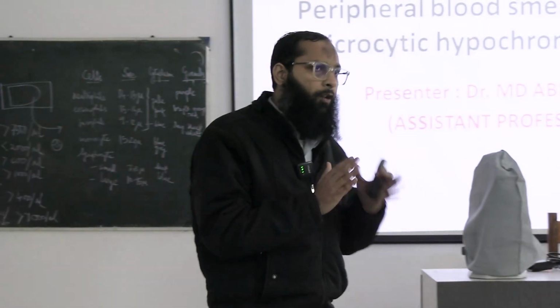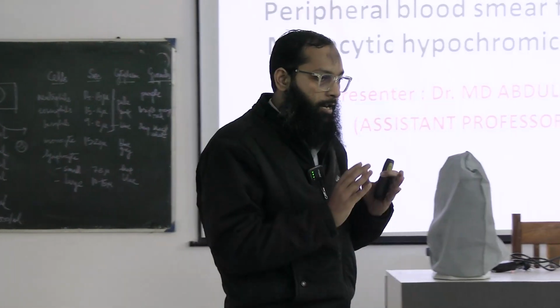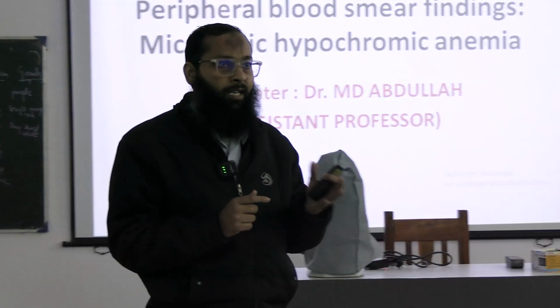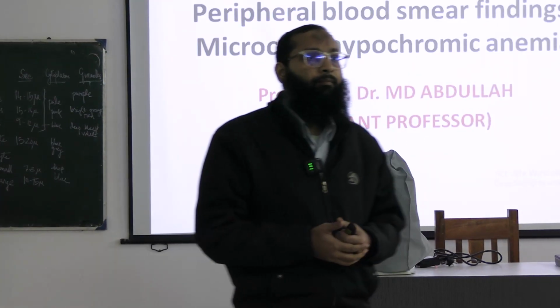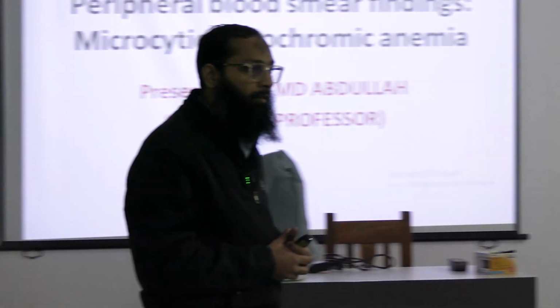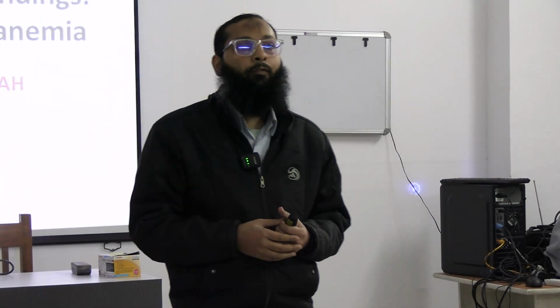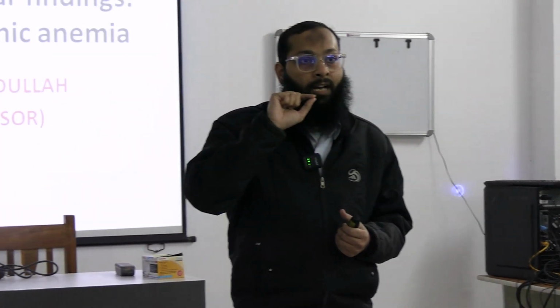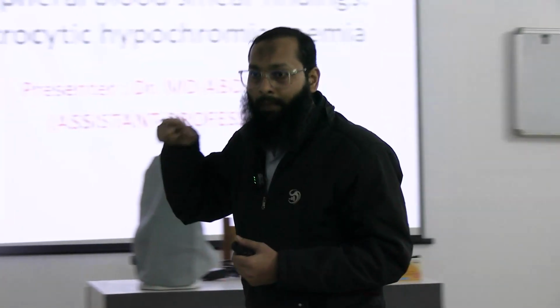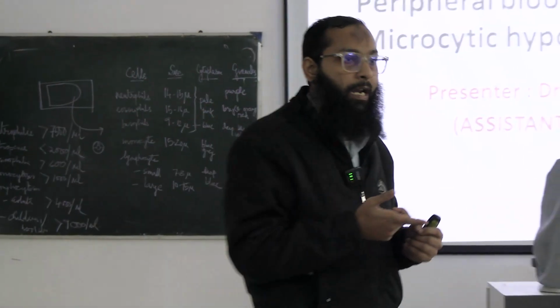Before staining, what will you do? You have air dried and you are going to stain the slide. Before that, what is a very important step? Anyone? A very important step is making an identity on the slide. Writing your name or giving any identity, because that is important.